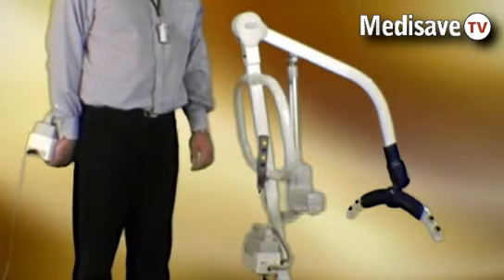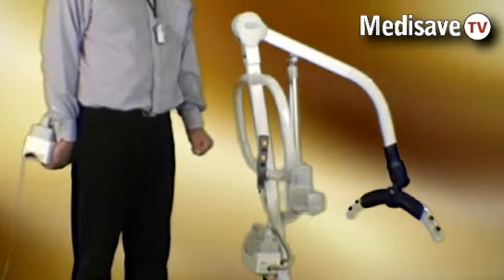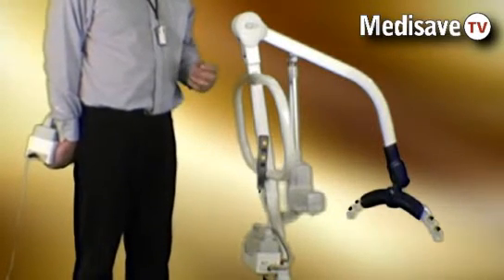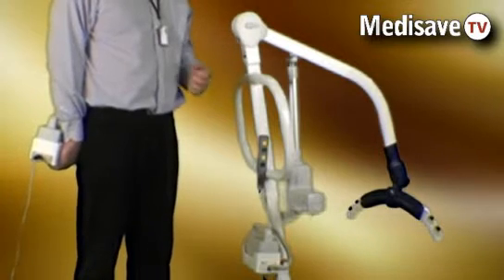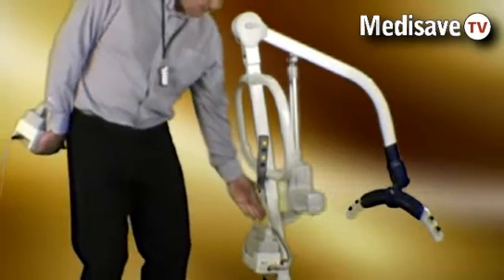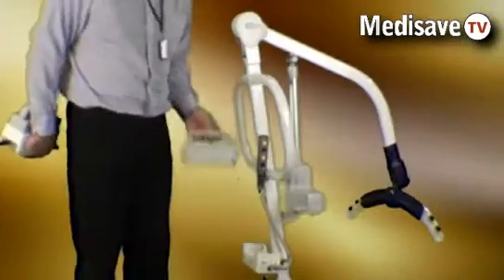Welcome to the Medisave demonstration of the locomotor hoist range. The locomotor range of hoists and standers are fully controlled with electrical operation via a rechargeable battery. The battery sits on the control box and is easily removed for charging.